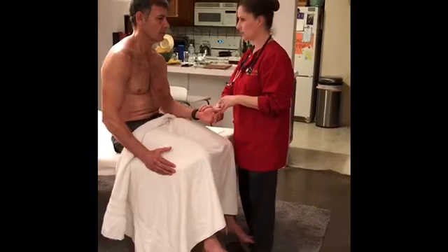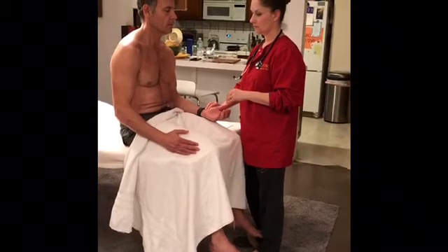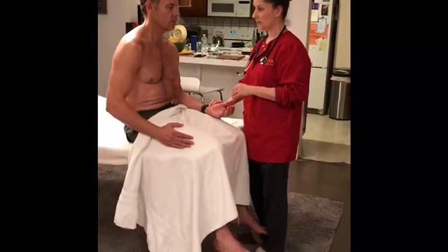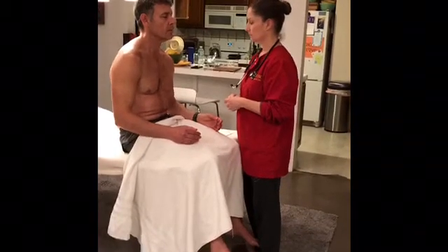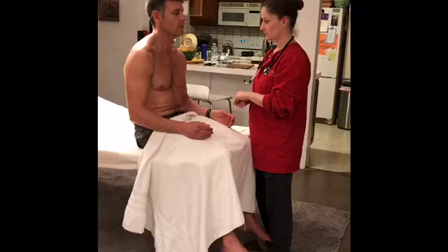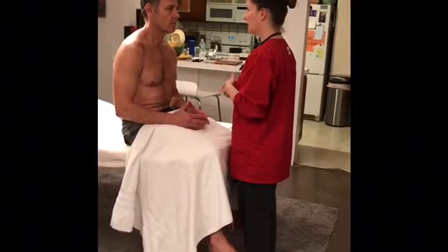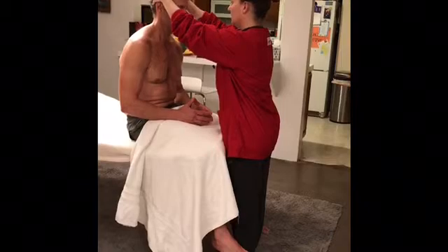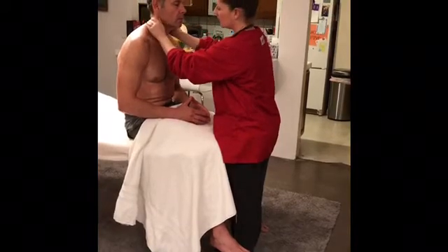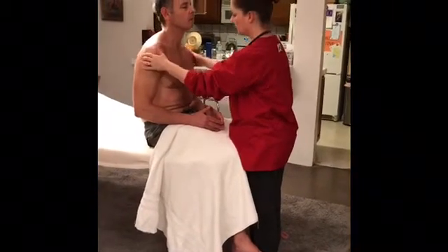So I'll go ahead and do his pulse. Which is about 70. And go ahead and breathe normally for me. Perfect. And I would take his temperature and also do his blood pressure. So Mr. Hawkins, I'm first going to start, like I said, with the head to toe. I'm going to first come in and feel the patient's scalp, looking for any lesions, any lumps. All the time, I'm always going to be inspecting the patient's skin for color, edema, any lesions, or anything that I might be concerned about.